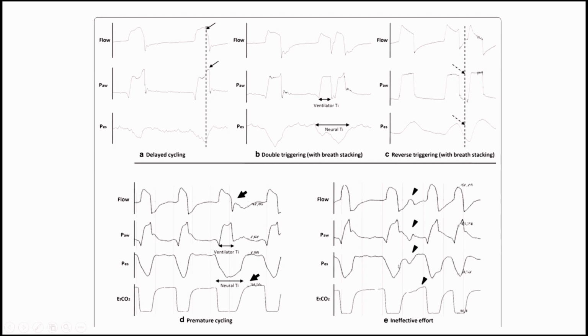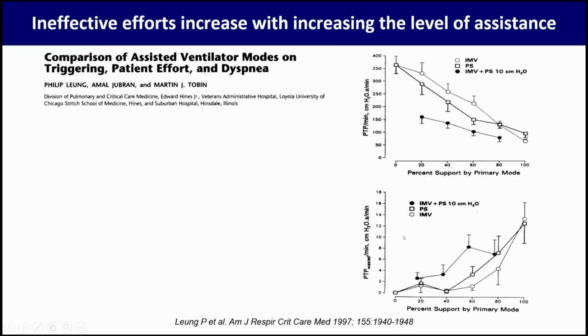This is the ETCO2. This is the esophageal pressure. This one is a deep effort, so a breath is being delivered, but this one is a very weak effort, and this is not followed by a breath. So this is again an ineffective effort.